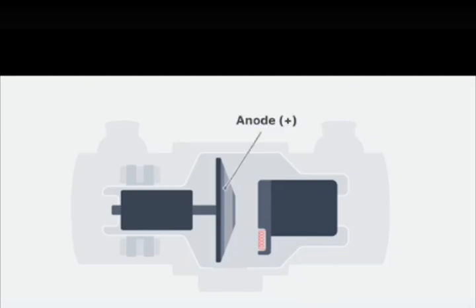The next major component of the X-ray tube is the anode. The anode absorbs electrons and creates X-rays. The anode is positively charged. This makes sense as the anode attracts the negatively charged electrons from the cathode. You can remember the charge of the anode and cathode like this. You want an A+, not a C-, in X-ray physics.